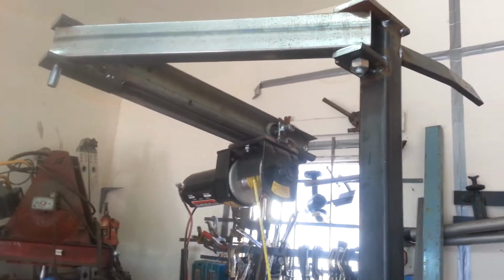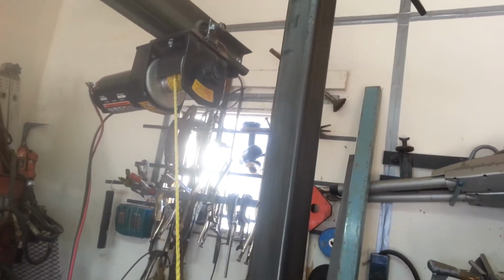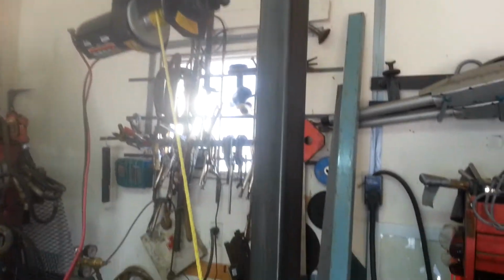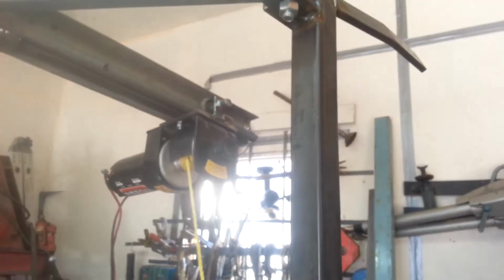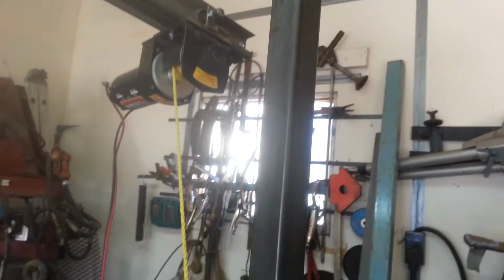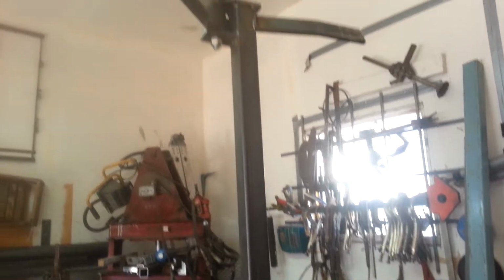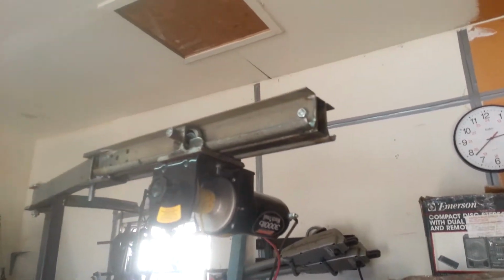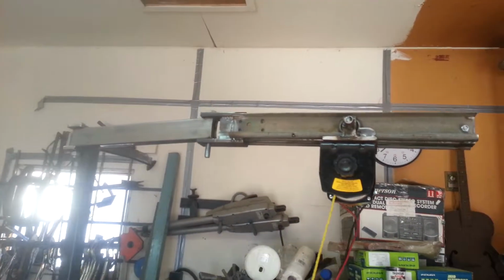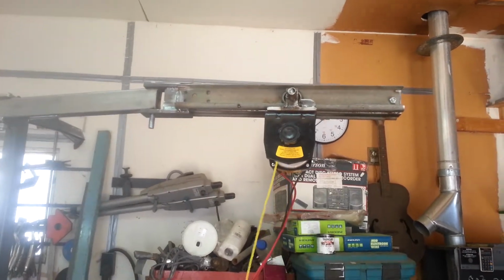It's facing towards the back of the van, and to get it ready for usage, I've got it hooked down to an eye that I welded on the post, and I just slack her off a bit, and you can pull the whole thing right around. It all moves, double jointed, and now here it is in its full length, sticking outside of the van approximately 44 inches.